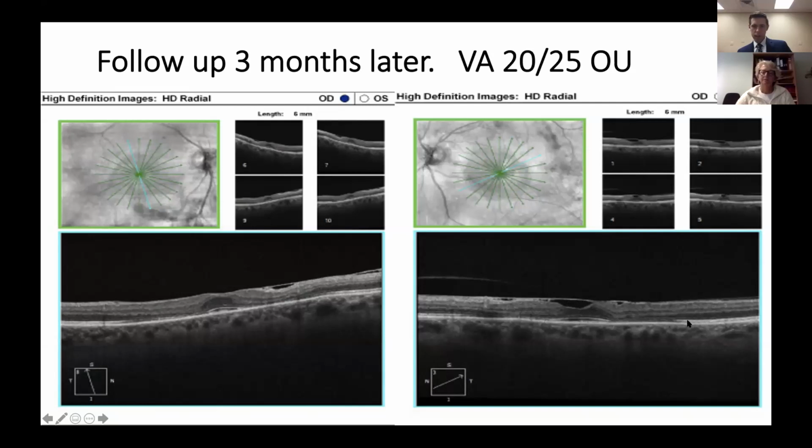And if we look along the outer retinal layers, there may be some outer retinal atrophy and loss, and that could be from long-standing hemorrhage, which can overall be toxic to the retina if it's in the deeper layers. But she was, again, seeing 20/25 without any surgical intervention. So overall, a fairly positive outcome in this case.